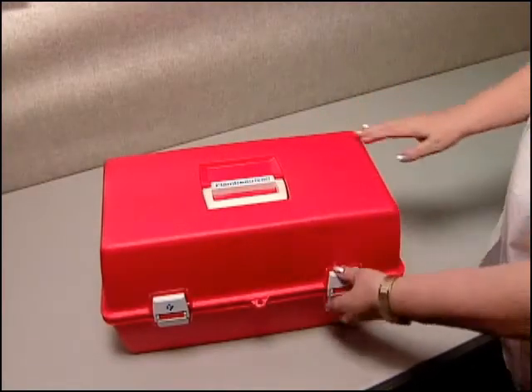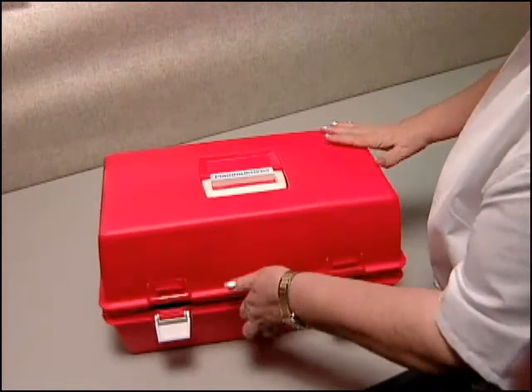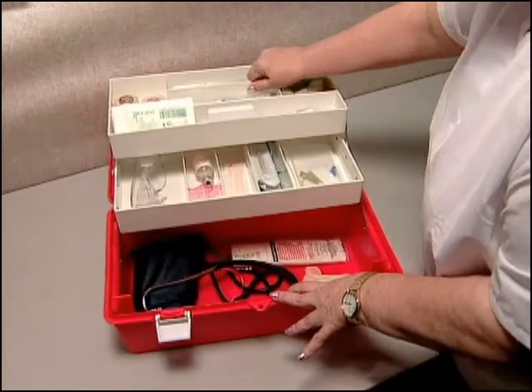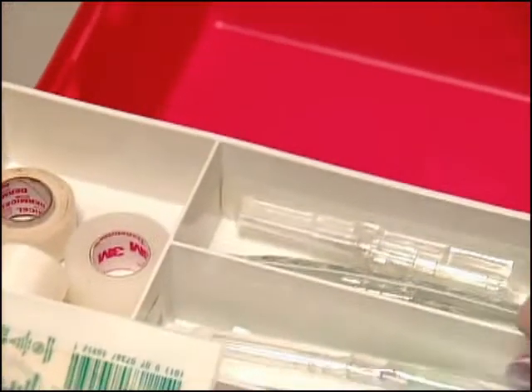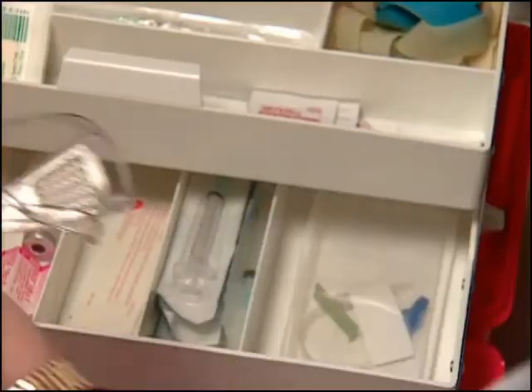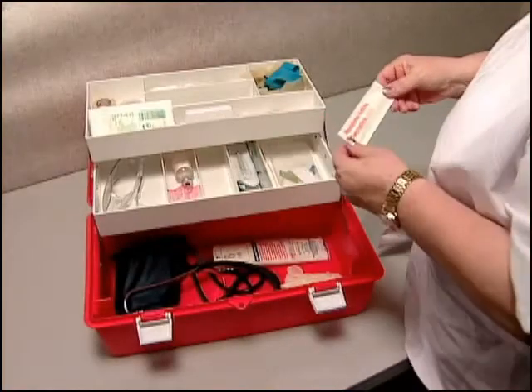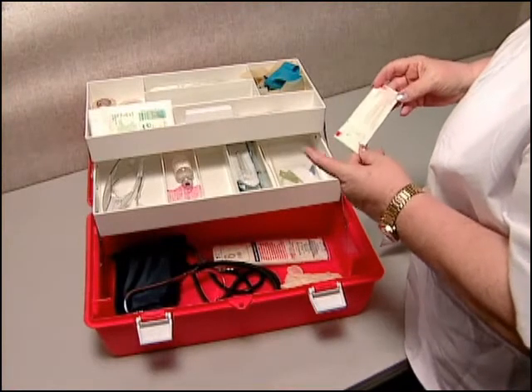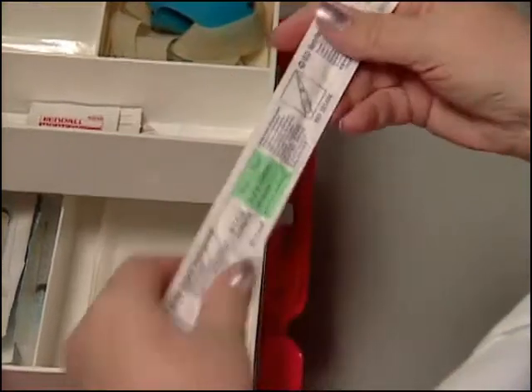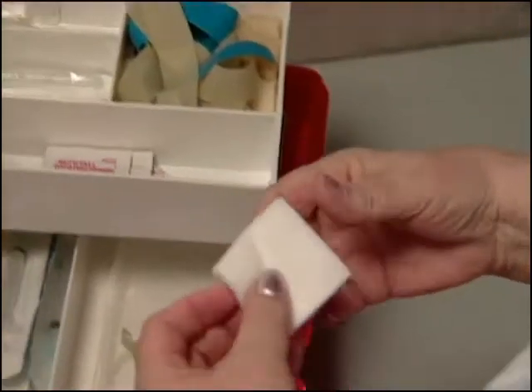Base your equipment and insertion site choices on the reason for insertion and the patient's physiological condition and diagnosis. Although it is important to bring everything you need to the patient's side, take care not to overstock. Overstocking is cumbersome for you and costly to the patient and/or the institution. Limit your equipment to the things you absolutely need, plus one extra catheter and several wipes.